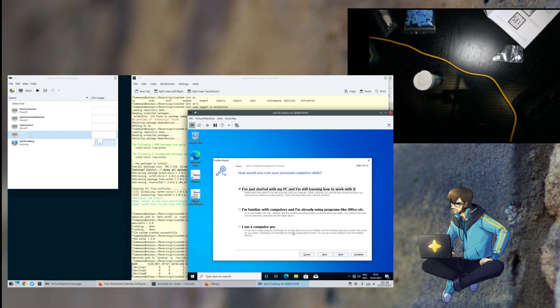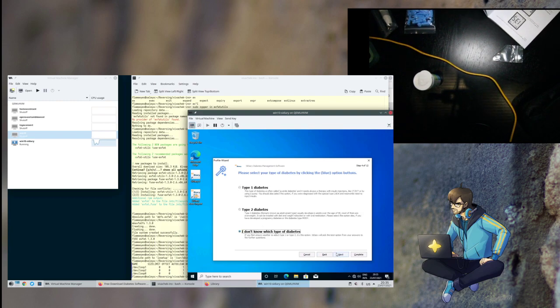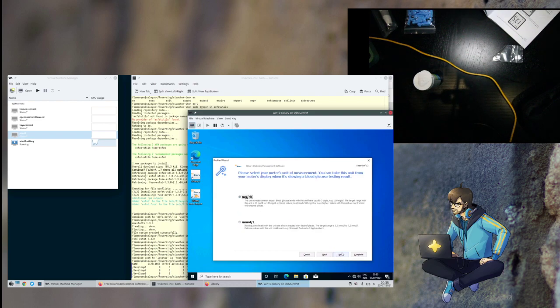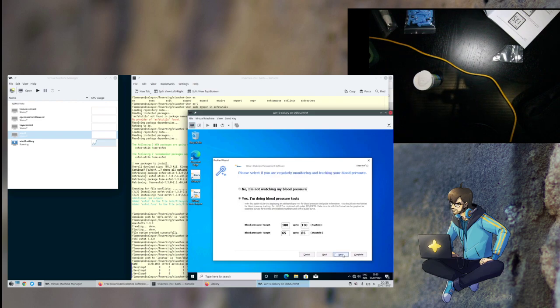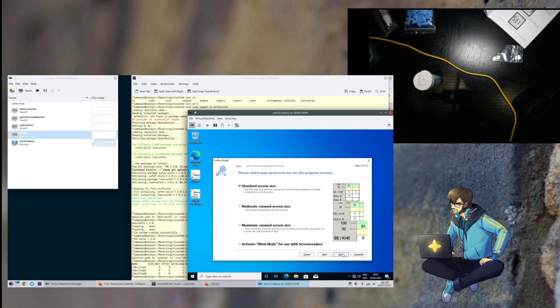There you go. Okay, so this is two. I'm Computer Pro. Yeah, yes, I am. Can I next through? No, I don't want to put a name. Test, test. Yeah, it's neither type one nor type two. Sure, I'll actually give a real answer for this one, and I'll take the millimoles per liter. Yeah, just check the normal defaults. Did I miss something? No, I don't care about the blood pressure right now. Yeah, simplified logbook will do fine. I just want to figure out how to download the data out of the thing.